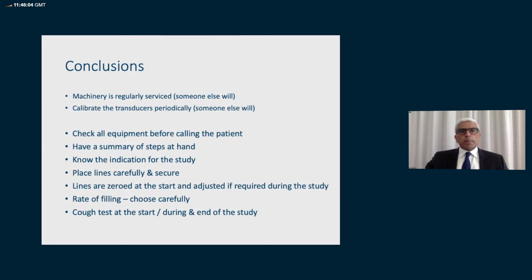So in conclusion, the machinery should be regularly serviced, which someone else will do. Catheters: one needs to calibrate the transducers periodically. Again, it is done by the team in the hospital who looks after the medical equipment, or it's done by the clinical scientist in our department.